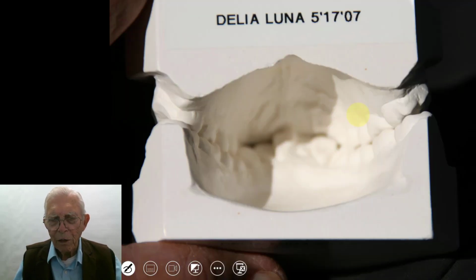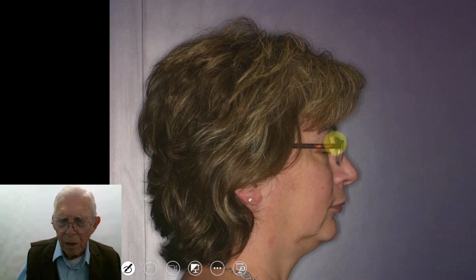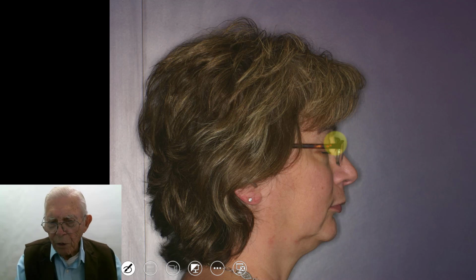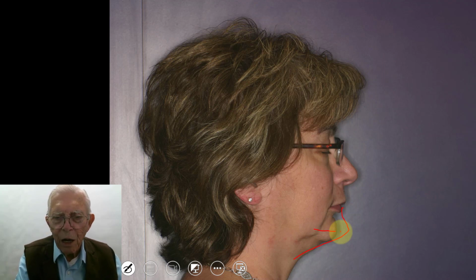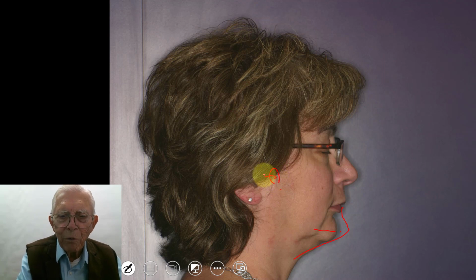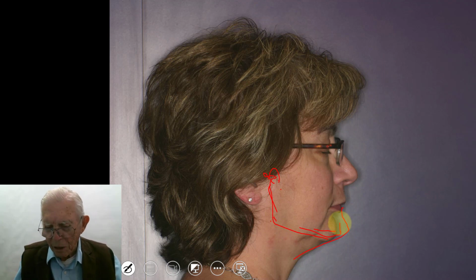You see, that's not clear in here, but anyway, these teeth are way up at the roof of the mouth, right like that. Now when you look at her, you look at the jaw, and you would like to bring this chin forward like this. We can't make this jaw grow, but you can bring it forward with a ramp appliance that makes her bite the jaw forward. And so the condyle back here at the back will lean backwards, and that helps the jaw come out, and this angle down in here will get greater, and that allows the jaw to come forward, but the jaw is the same size, the angle and everything, but the jaw is no bigger.